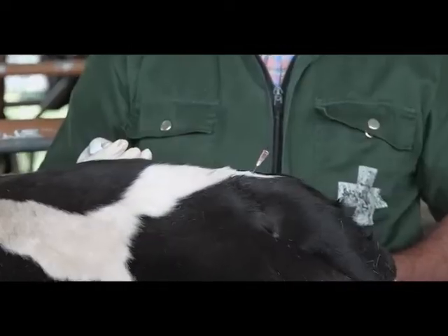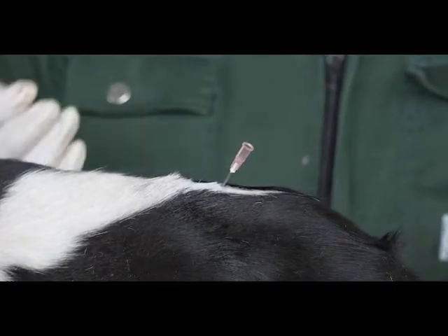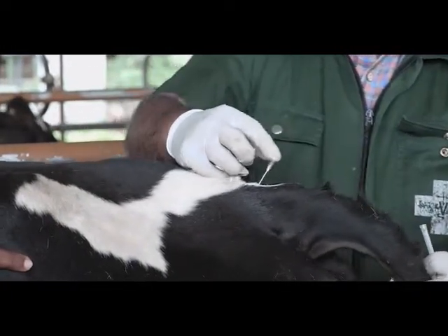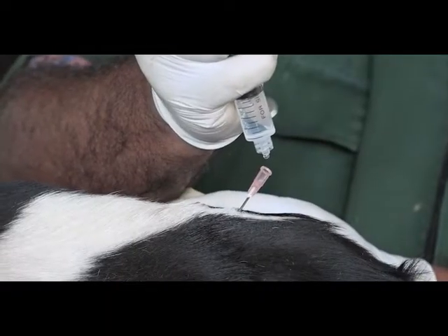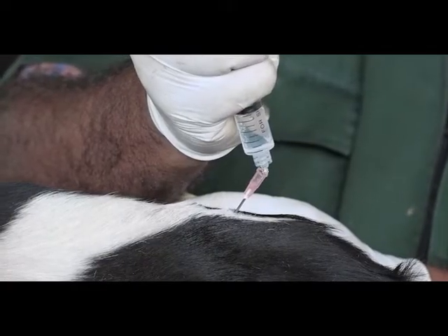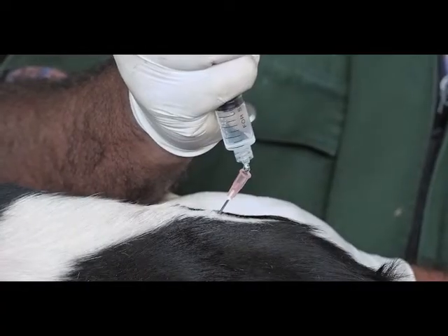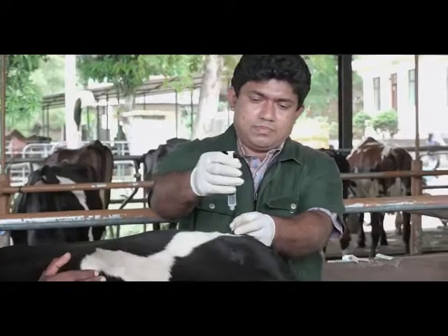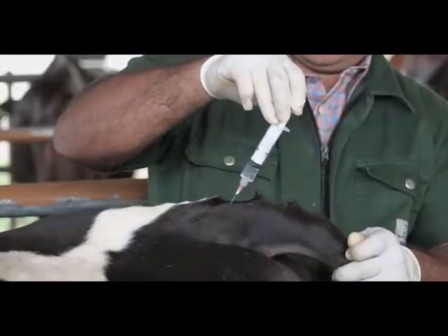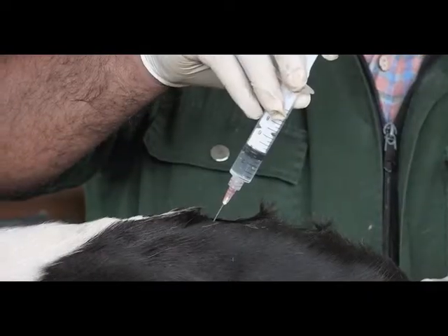There are a couple of ways to ensure that the needle has reached the epidural space. The first way, you will feel a pop as the needle enters the epidural space. Also, you can put a few drops of the drug to the hub of the needle and see whether the drug will move freely into the animal's body as shown. The third way is to connect the drug-filled syringe to the hub of the needle and pull the plunger back to see whether air bubbles are coming without much resistance.